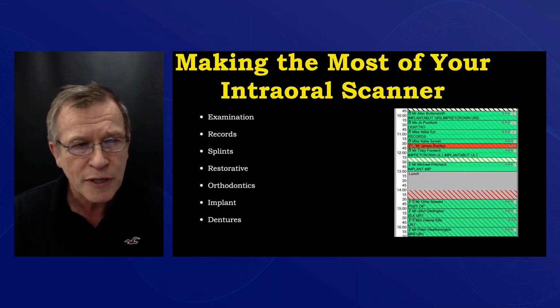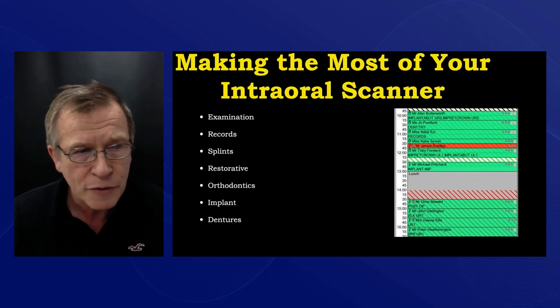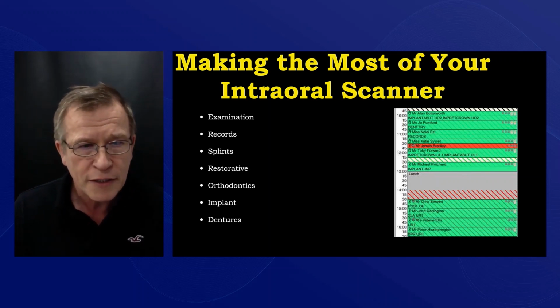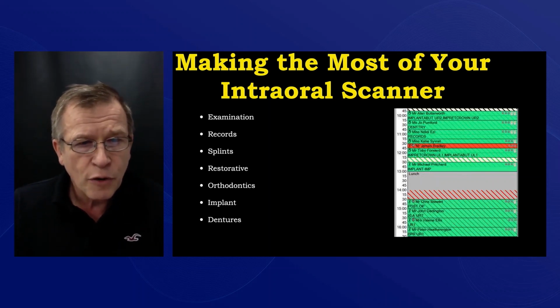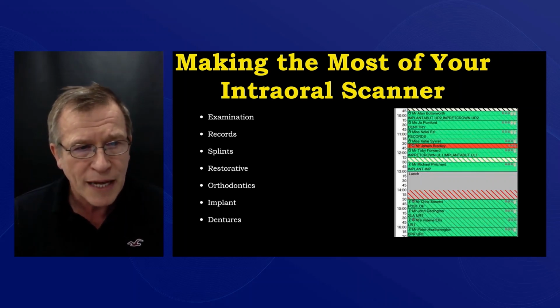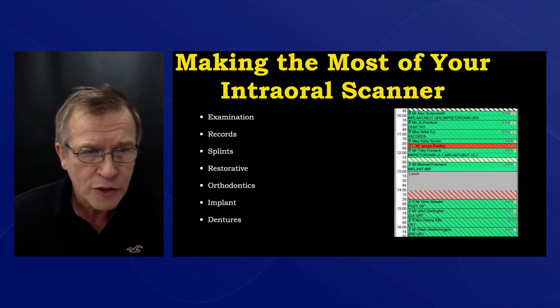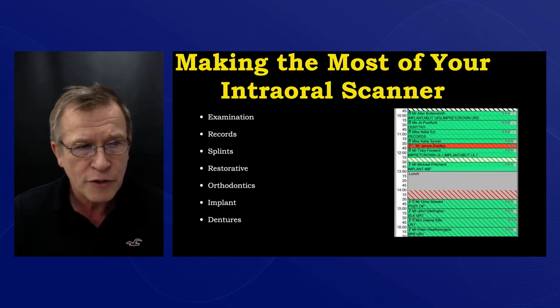Obviously, we use it to communicate with our orthodontist, and also for some GDP orthodontics that you would do in your practice. It also has made implant dentistry so much easier, from the planning stages and again from communication with our implantologist colleagues to the restoration part of what we do.